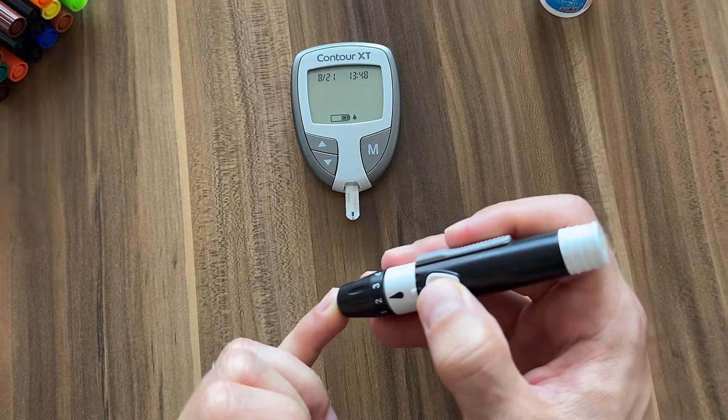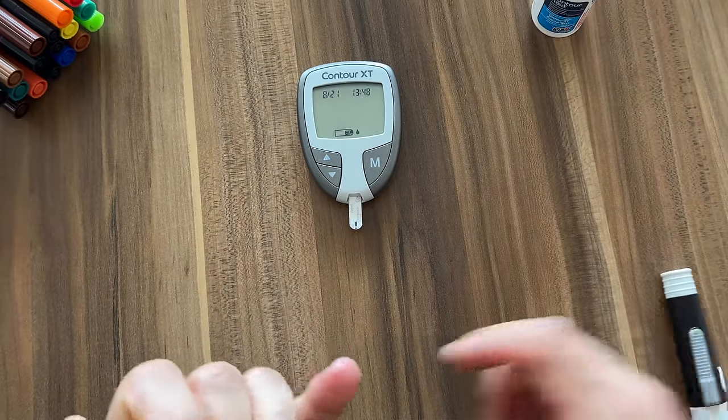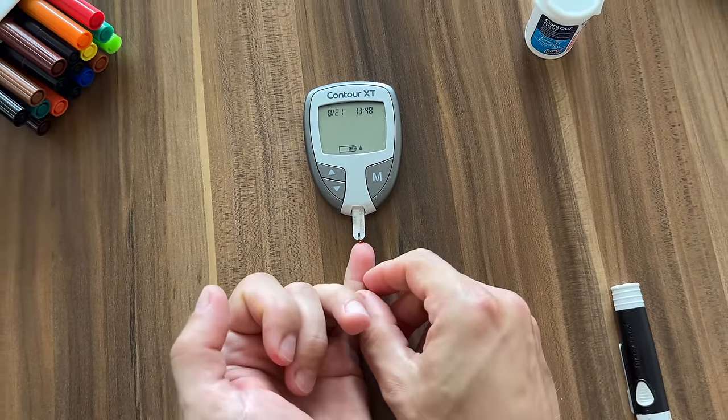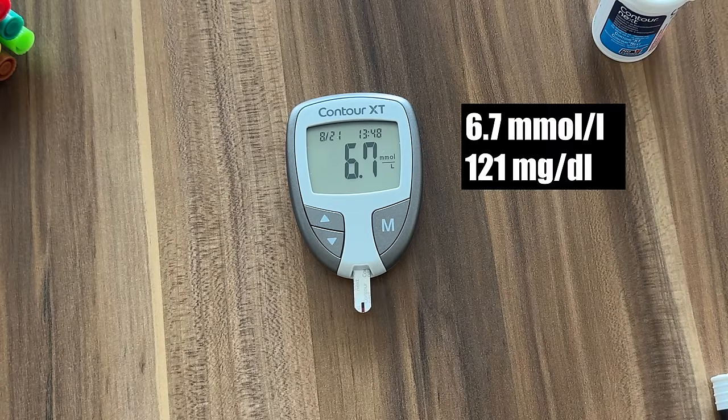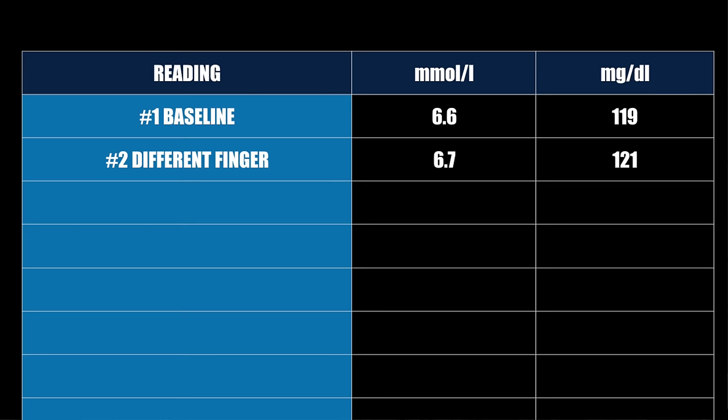I took the blood sample for the first reading from my index finger, but let's see what happens when we use a different finger. For reading number two, not even a minute after the first one, I'm taking blood from my pinky finger. I expected it to be the same but it wasn't. We're only taking a small blood sample for each test, so the sample from each finger might be a little different. The reading from the pinky is a tiny bit higher — 6.7 or 121 — but such a small difference is nothing to worry about.